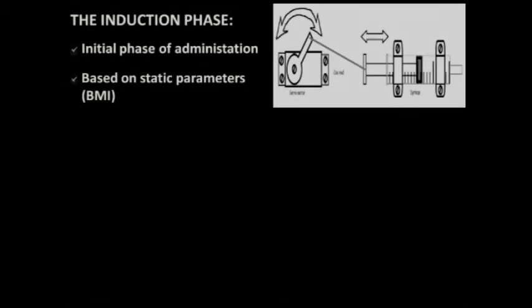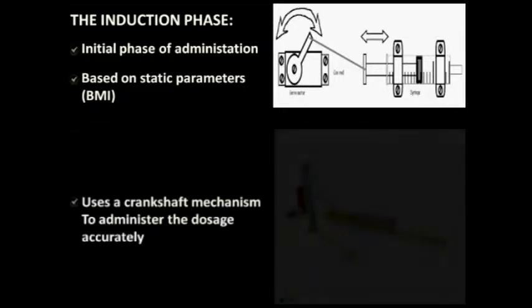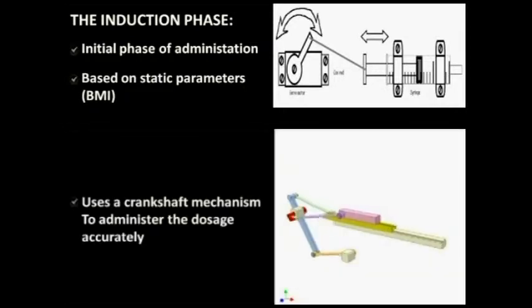There are two stages of anesthesia administration, the induction phase being the initial phase used to put the patient to sleep and is determined by static parameters like the age and body mass index. Precise induction of the anesthetic is achieved by using a crankshaft mechanism as shown.